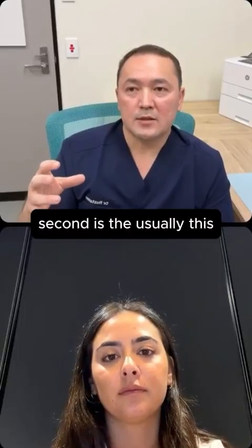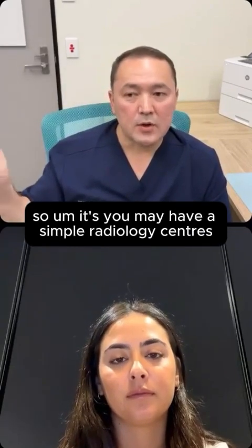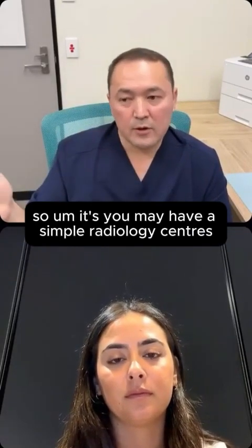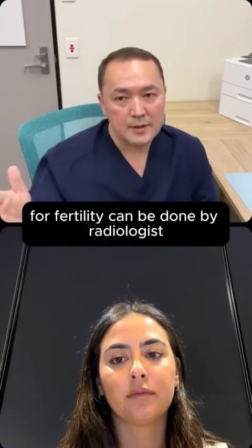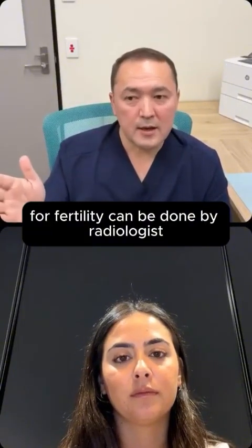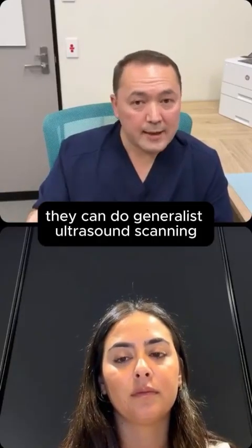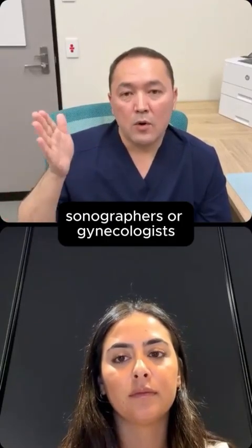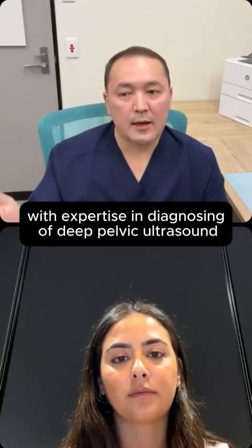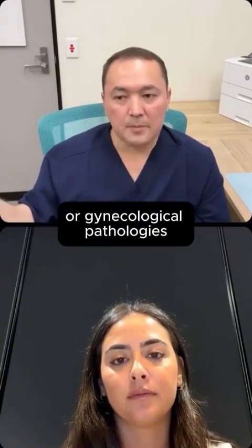Second, these scans are usually done in specialized tertiary level imaging centers. You may have simple radiology centers where gynecological or baseline ultrasound scans for fertility can be done by the radiologist. They're not quite specialized in one area. They can do generalist ultrasound scanning, but deep pelvic scanning is done by tertiary level sonographers or gynecologists with expertise in diagnosing deep pelvic endometriosis, adenomyosis and other uterine or gynecological pathologies.